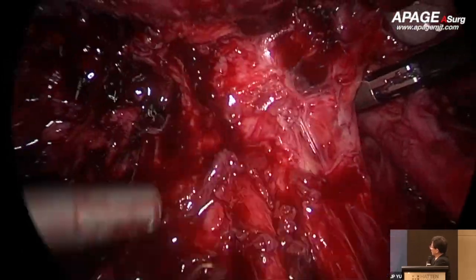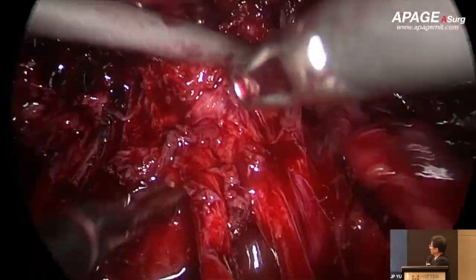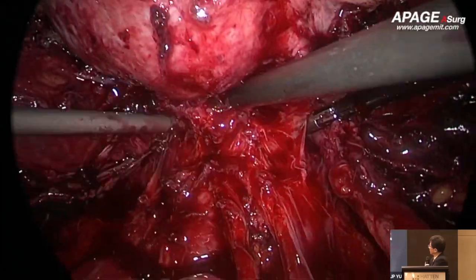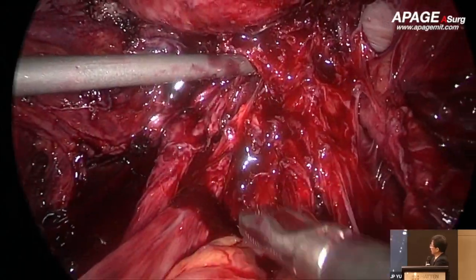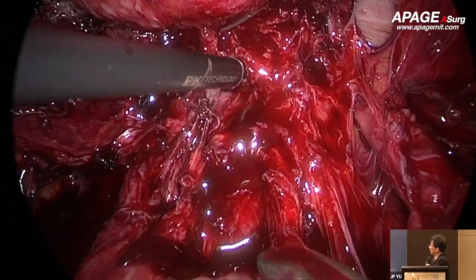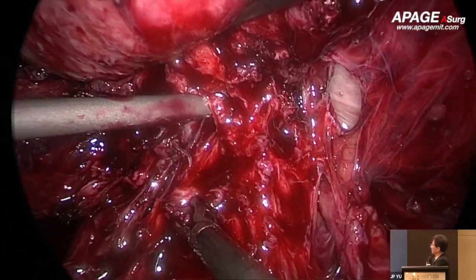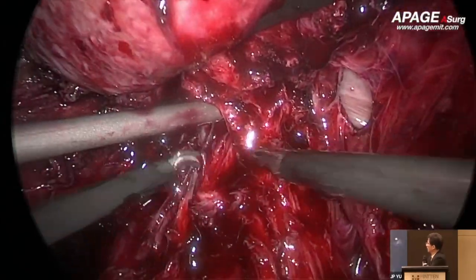Before resection, the colon and the ureter are joined together here. If we don't dissect it, there will be colon damage and also ureter damage. Also, in cervical cancer we need to remove a little more cervix from the lesion. If you don't resect this, you just amputate the cervix, which would not be good for cervical cancer surgery.